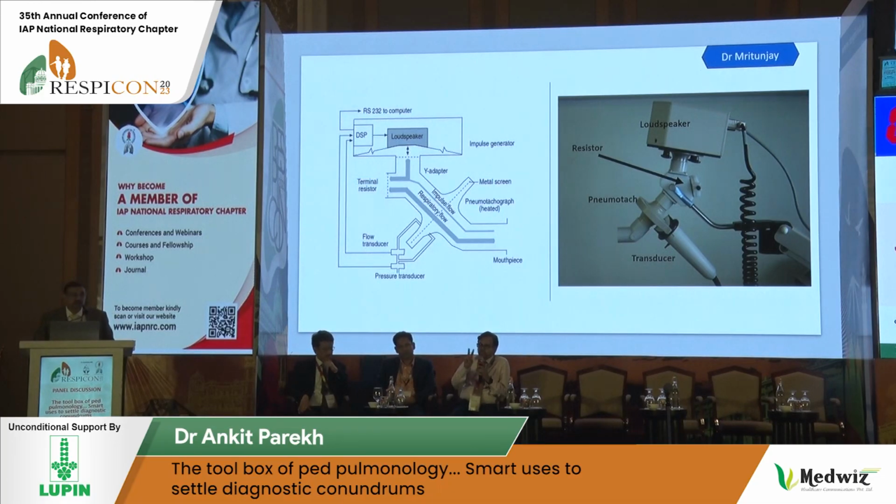And the second is the small airway disease, which is not picked up by spirometry, but you can pick it up with this tool. As told in different literature, in about 30% of children and 50% of adults, the asthma is small airway disease. And for the medication for small airway disease, now we know small particle steroids are coming up, so it may be different.